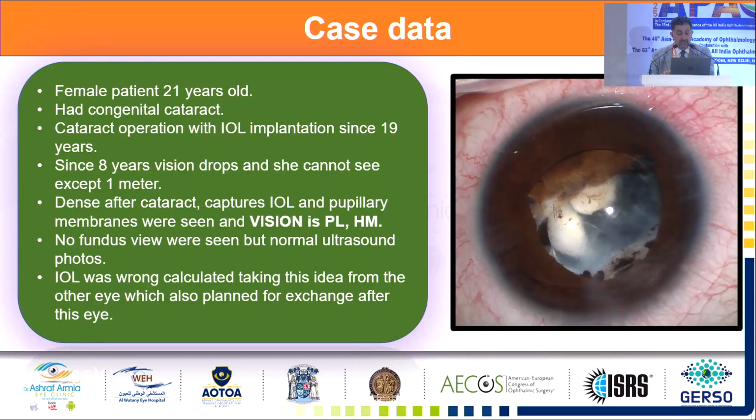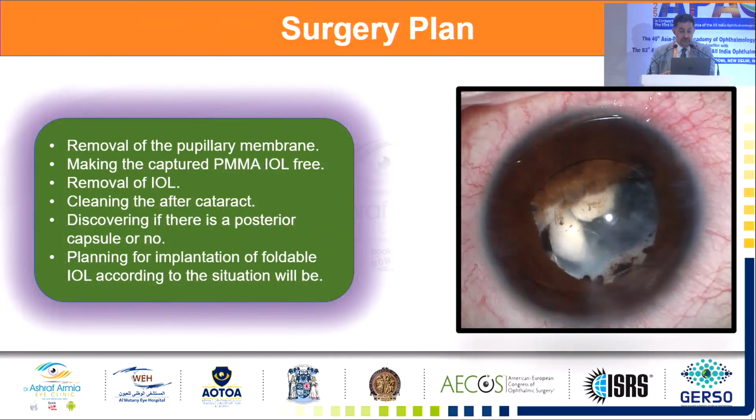Taking this idea from the other eye, which is also planned for exchange after this eye. In a critical situation, you should always make a plan before you go for the surgery. So this was my surgical plan.